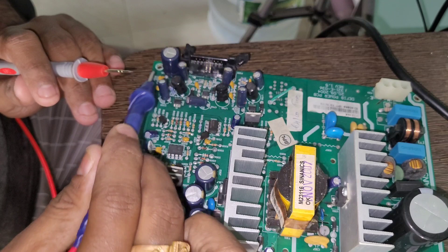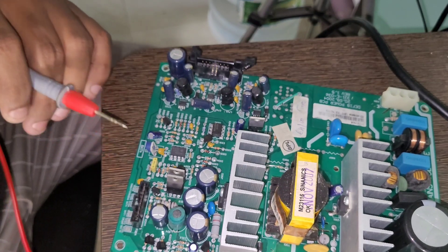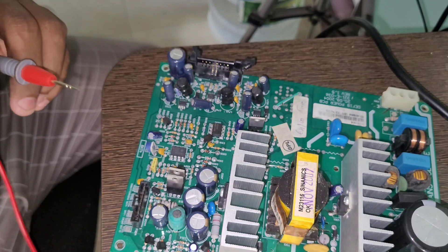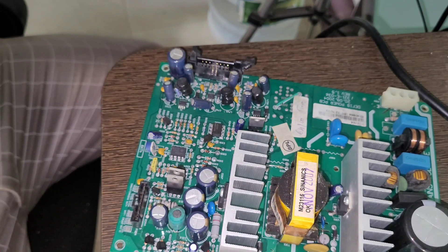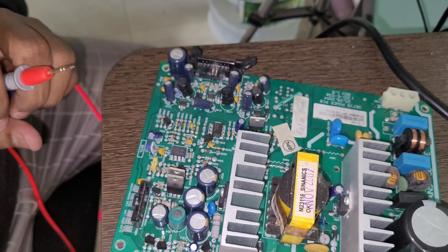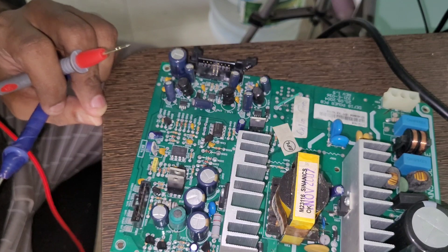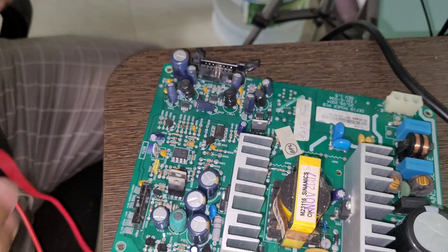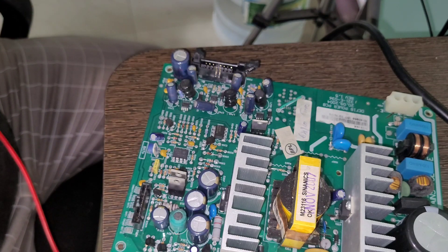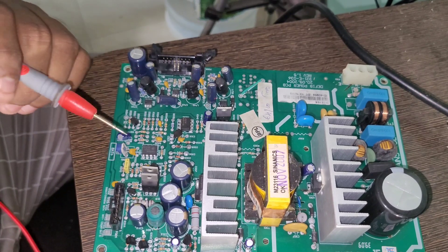Now I'm going to do a visual check. Sometimes we can know the problem through visual inspection alone, and sometimes we have to check with the multimeter to identify the faulty component. When dealing with SMPS or SMD boards, visual checking is the most important first step. After that, you start checking components like capacitors, resistors, transistors, or MOSFETs — for which you should have a good knowledge of electronics.